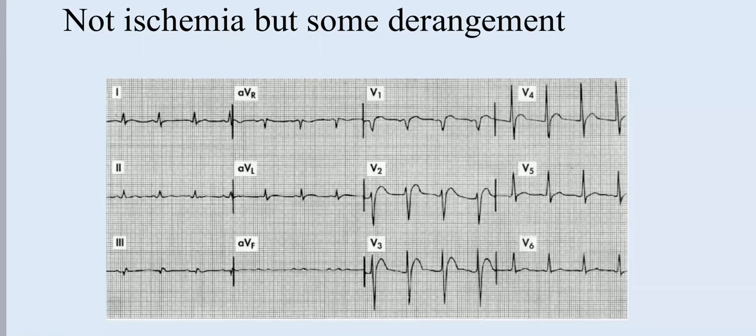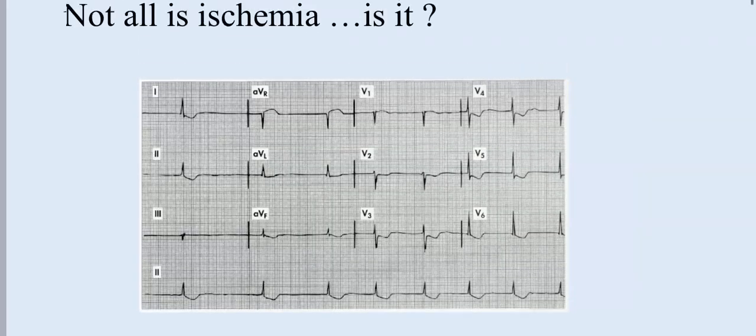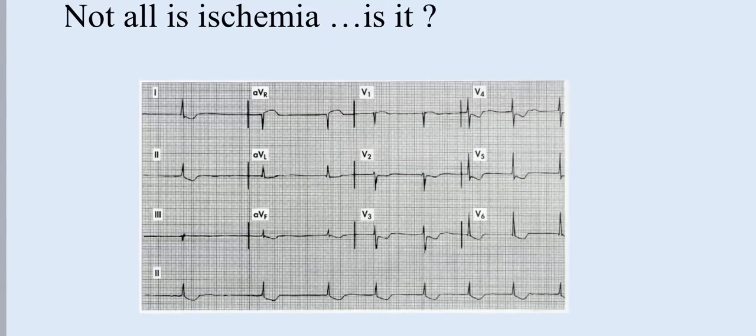Yeah. Digoxin effect is that scooping, that reverse tick, okay? But digoxin toxicity, the main manifestation, is different forms of arrhythmia, one of which is complete heart block.